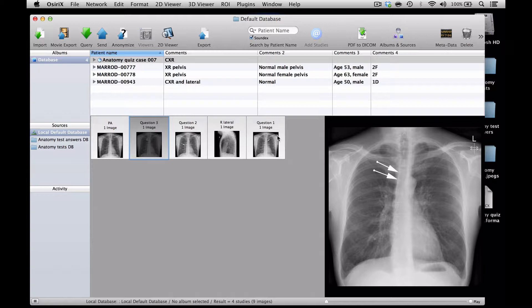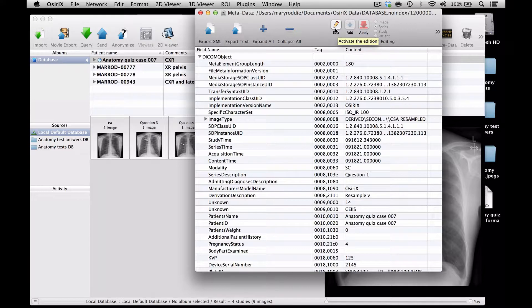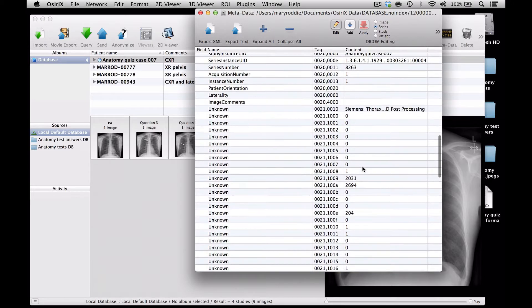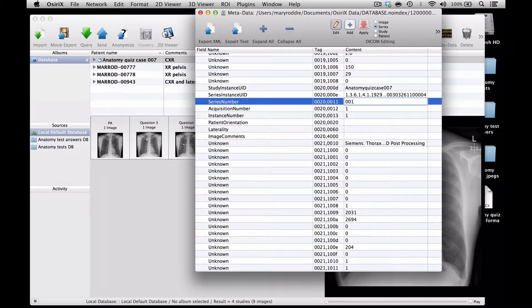In order to get the images to show up in a logical order to the candidate, we need to alter the series number. To do that, we need to go into the metadata and switch on editing — we'll get a warning message the first time. I go down to the part that gives me the series number. If I want Question 1 to be the first image, I make sure Series is selected, double-click and change it to 001. It's important not just to write the number 1 — you must have a couple of zeros in front of it. Once I've gone on to a new line and that's turned red, I apply it.